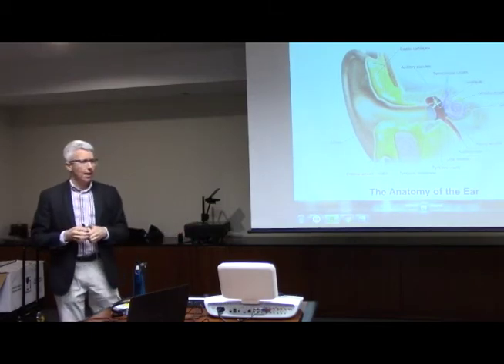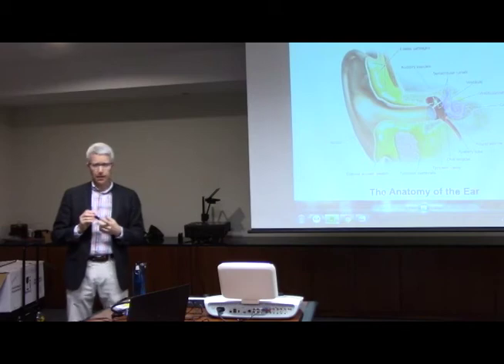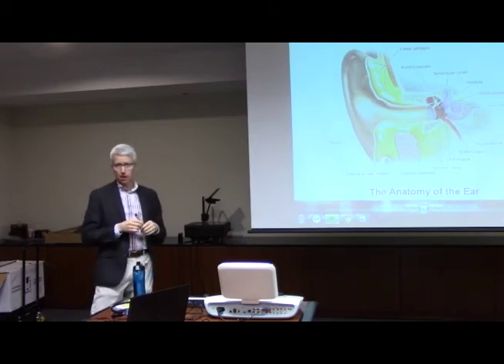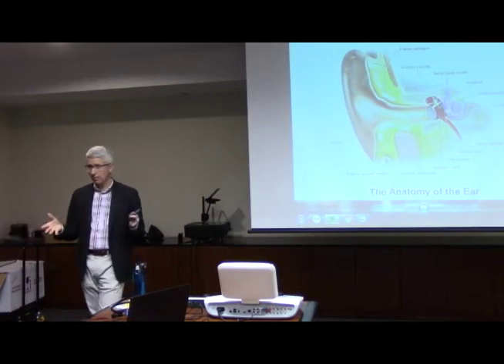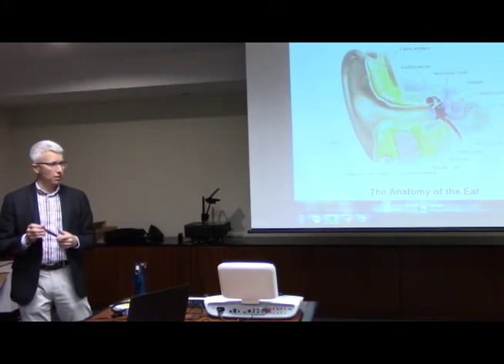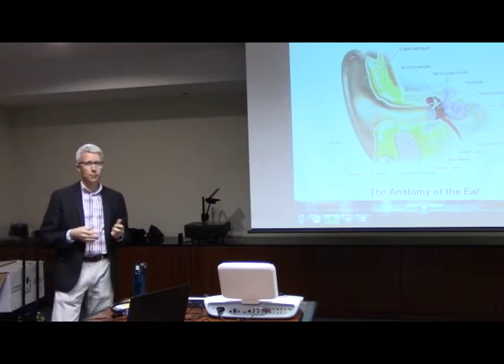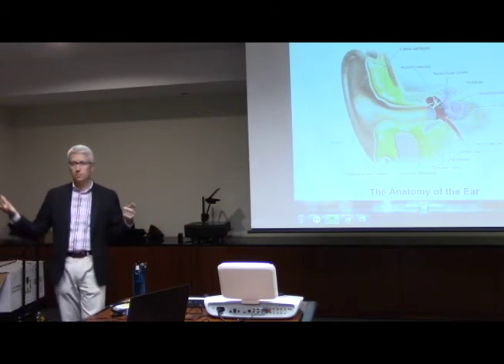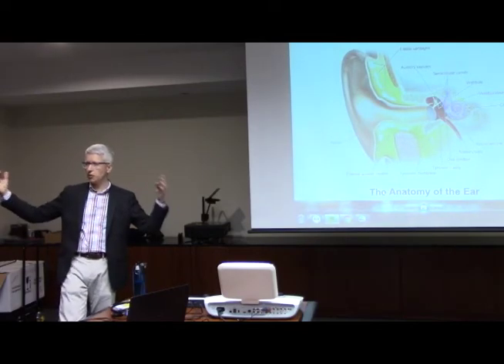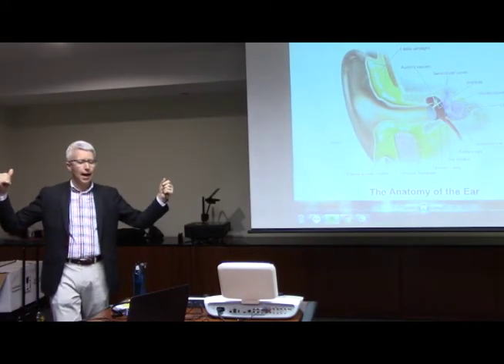Okay, so something that I'm not going to be able to bring in too easily, or at all really. Three other things that I want to touch on. I'm going to touch a little bit on sound booths, but that's something that we can probably talk about another day. But speakers I mentioned a little bit, that for a clinical application, we will typically sell a couple of speakers, sometimes 3, but typically it's 2, so there's one on the right, one on the left.